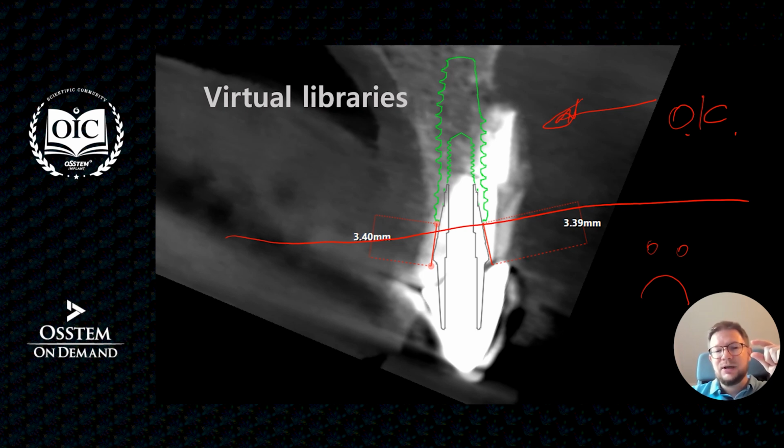And today we know from a lot of researchers in the literature, studies on implants and digital studies, that we should cover some features of that place which influence a lot the supra-implant complex, the health of the tissue around the implant, and the stability and the aesthetics of that tissue.